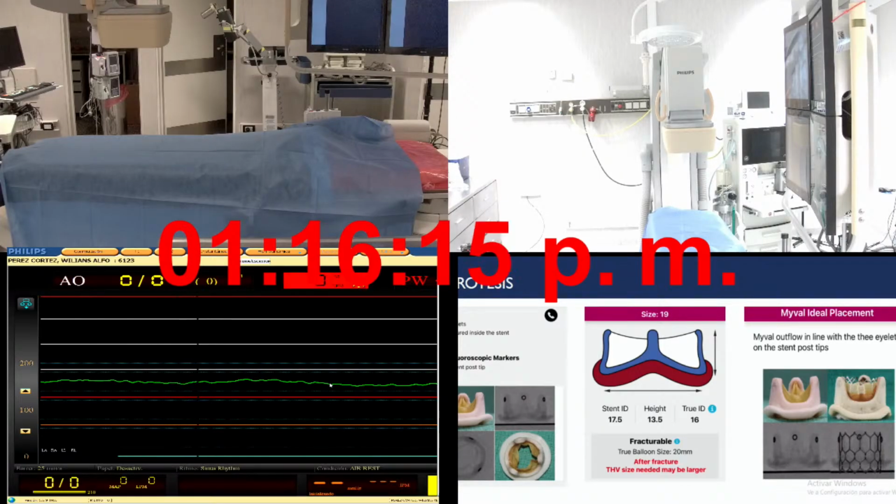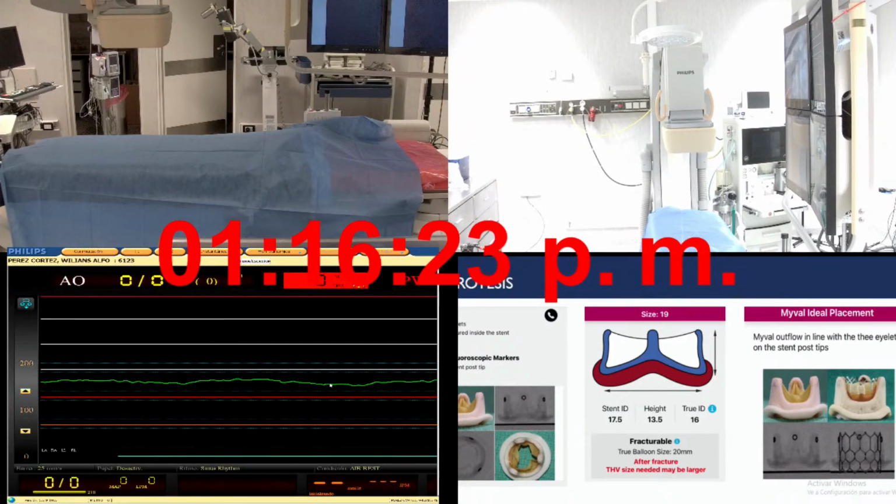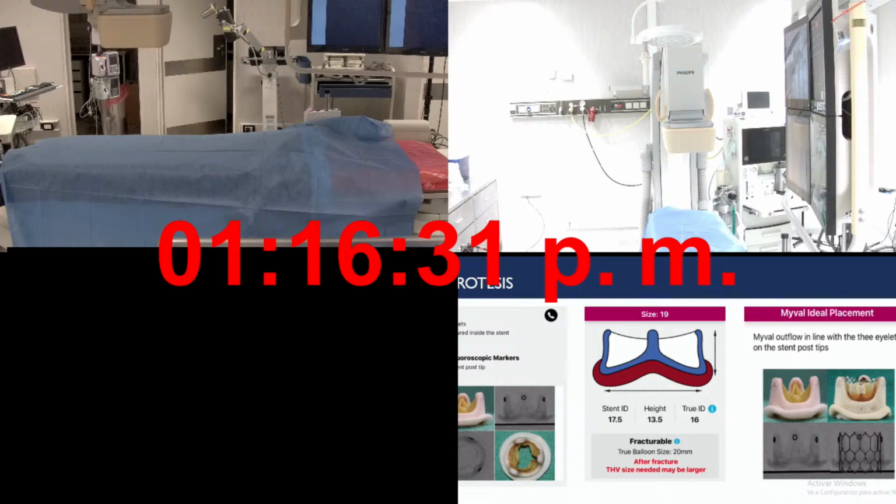Image in the upper quadrant, and there's extensive lipid a little bit further down in the lesion, with evidence of thin cap fiber atheroma. So as per the randomization, this lesion will be managed medically, but as part of the OCT study, we'll be able to evaluate what happens prognostically to these lesions when they are left without intervention.